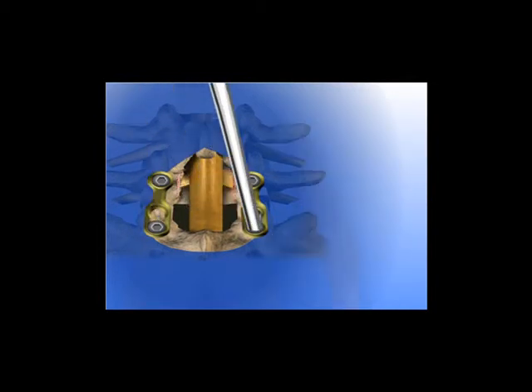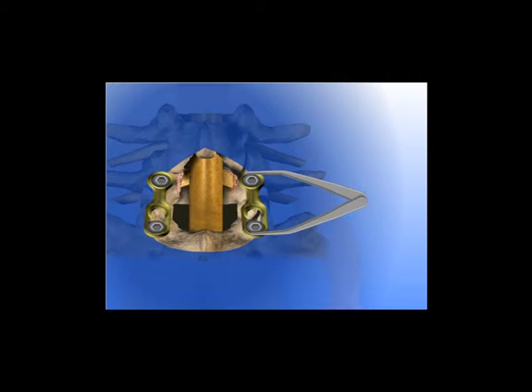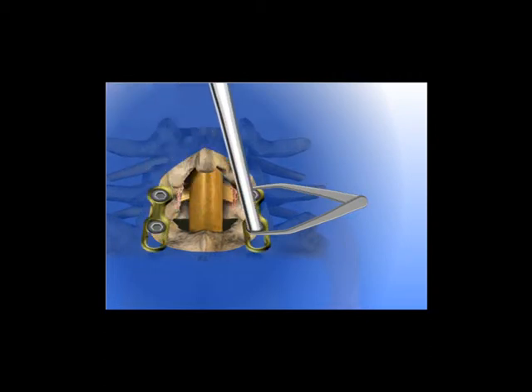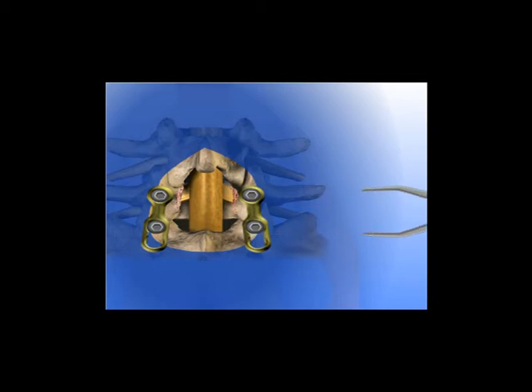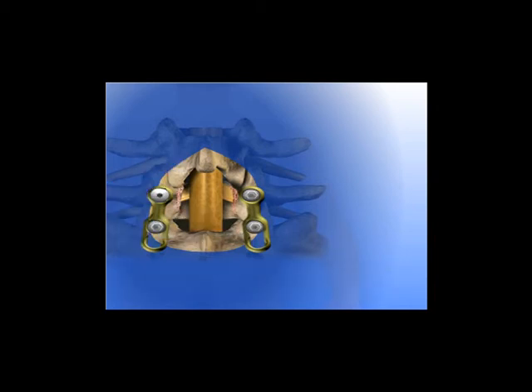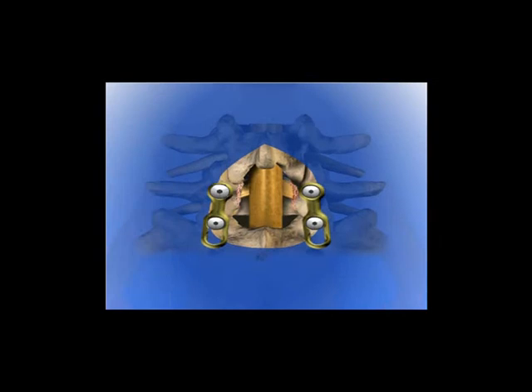To provide stability to the spine while the fusion occurs, the lower screws are loosened and the vertebral bodies are squeezed together. The screws are tightened in the compressed position, which allows for a tight fit of the grafts in between the vertebral bodies. Small screws called blockers are placed on the pedicle screws to lock the screws to the metal plate. The incision is closed and dressed to complete the surgery. Patients will typically be hospitalized for 2 to 4 days and should avoid strenuous activity for 6 to 12 weeks.